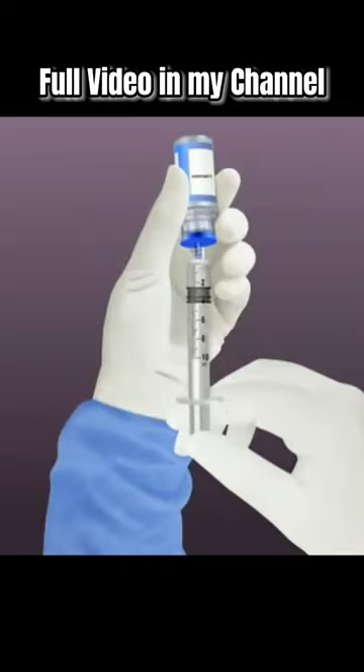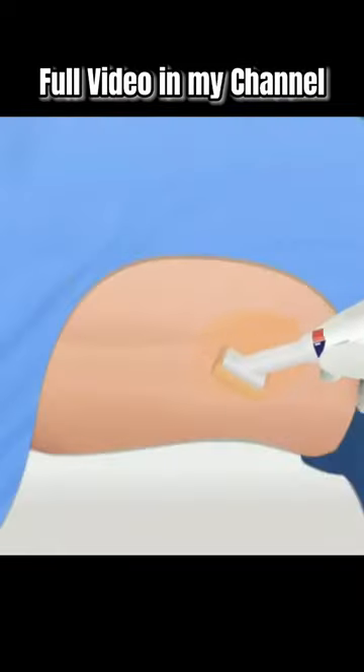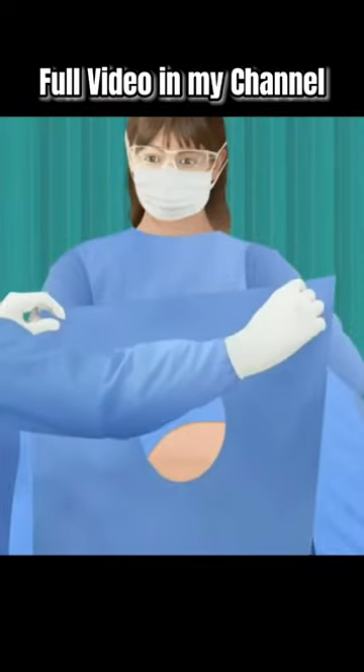Identifying landmarks, preparing local anesthetic, cleansing the site, draping the child, and repositioning as needed.